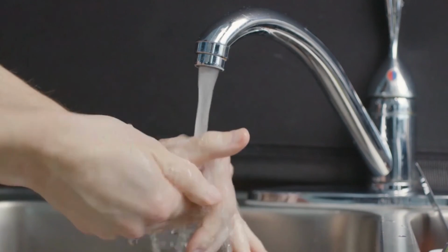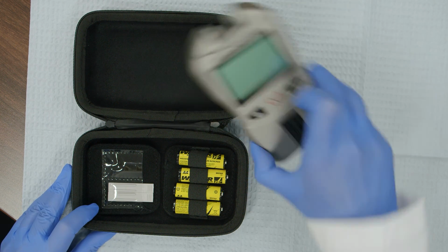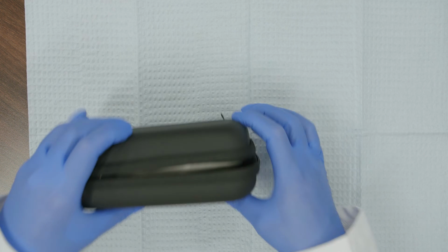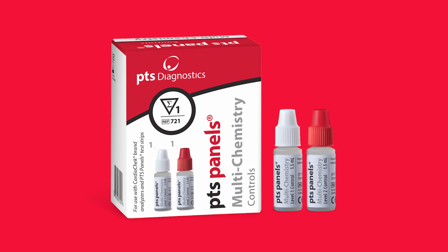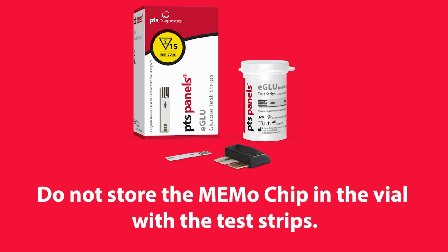Remove your gloves, thoroughly clean your hands, and put on a new pair of gloves before testing the next patient. Proper storage and handling helps protect the performance and longevity of your analyzer. Store the CardioChek Plus analyzer in the case provided at the temperature indicated in the user guide. Store the PTS panel's control materials and test strips at the temperatures indicated in their package inserts. Store the memo chip in the box with its original lot of test strips. Do not store the memo chip in the vial with the test strips.